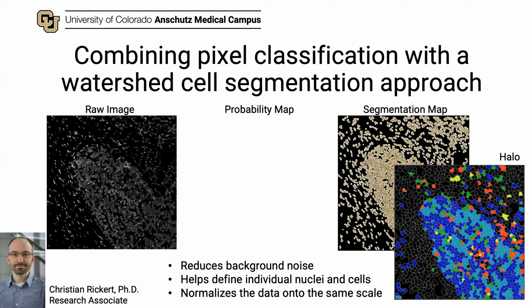This is the CU cell segmentation map that's generated at the end, and just comparing some of the other options out there for cell segmentation. We explored Halo, and you can see that Halo generates this sort of cartoonish cobblestone looking segmentation. I know that there's a lot of options in Halo where you can probably mess with this and get it to be better.